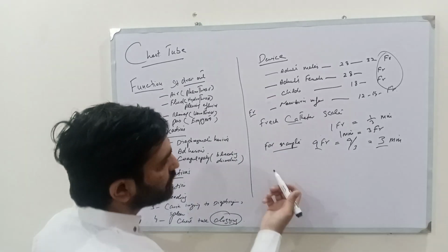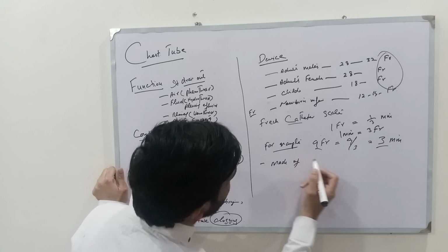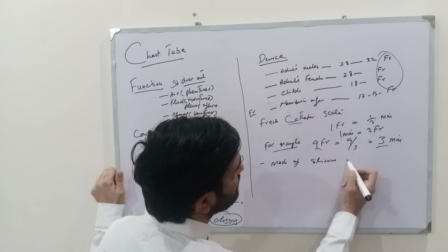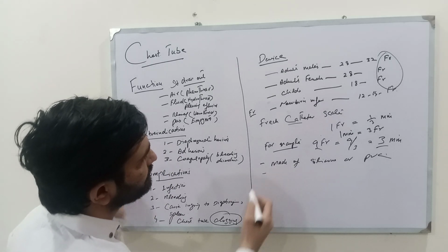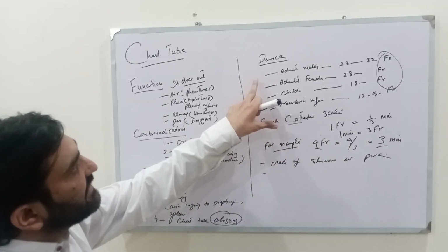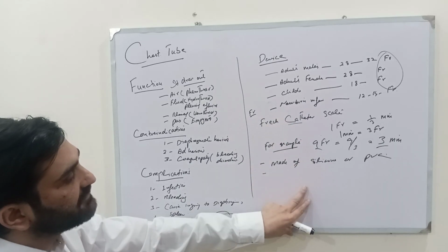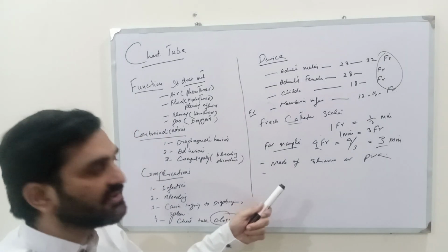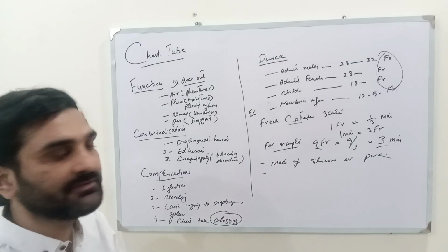Chest tube device or chest tube drain is made of silicone or PVC. Remember, there are two ends of chest tube catheter or thoracostomy catheter or chest drain. One end is attached to chest drain system, and one end is attached to patient.